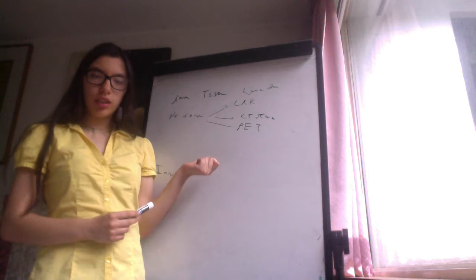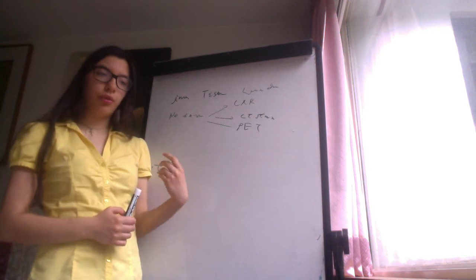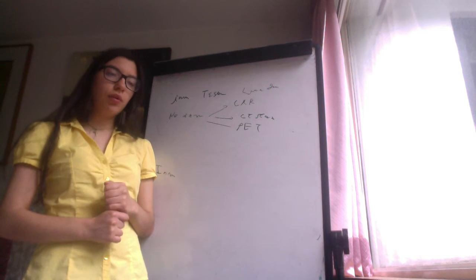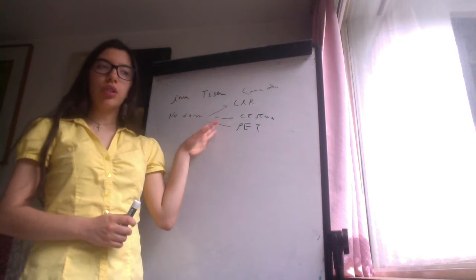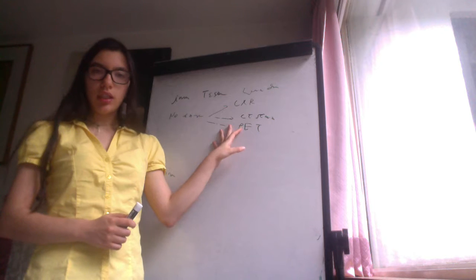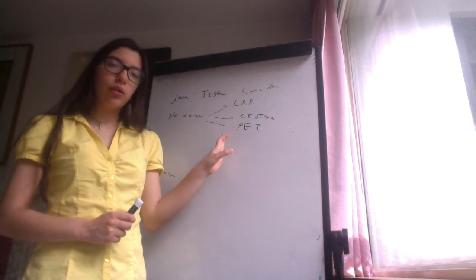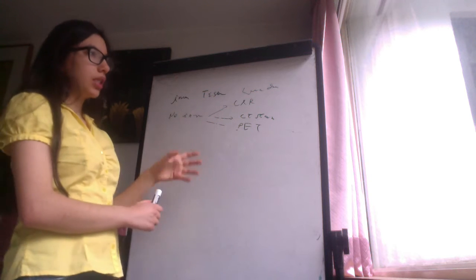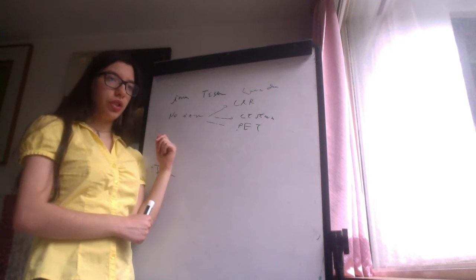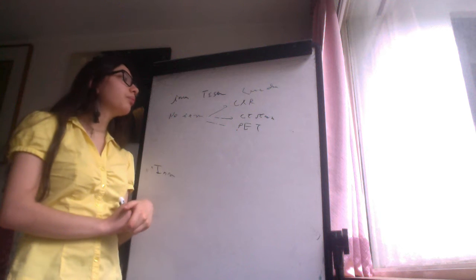Sometimes we can see lesions in the chest X-ray before the patient has symptoms, but we will not use chest X-ray to confirm the diagnosis of a pleural disease, interstitial disease, or the solitary nodule. But we can do chest X-ray, for example, for confirming the diagnosis of suspected pneumothorax.